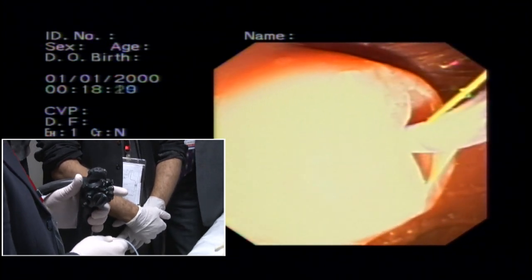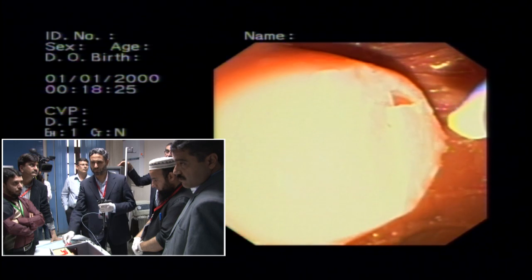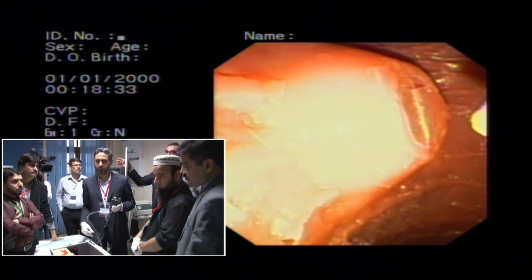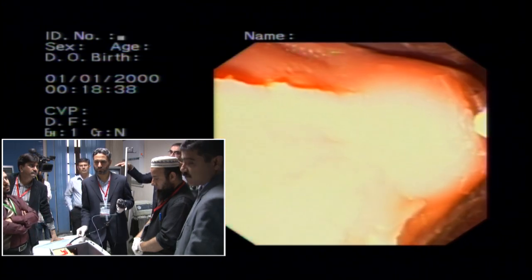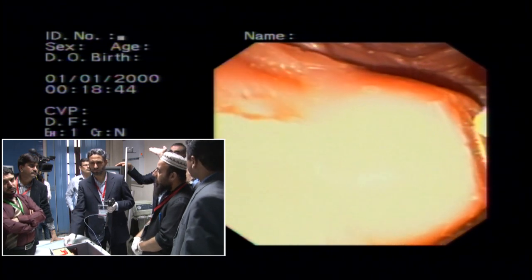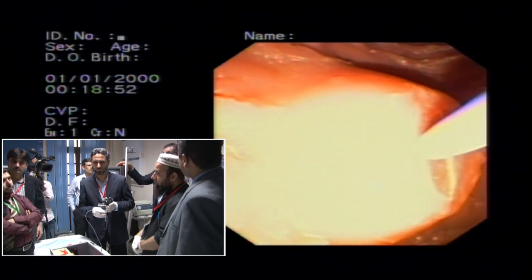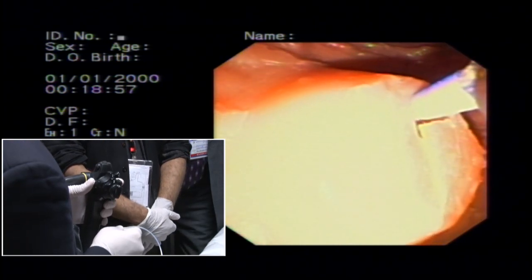जो आपका रेगुलर वायर डाल रहा होता है, अगर it is good, he'll tell you। खुद करते हैं, जब आप सीबीडी में होते हैं, unless you have a stricture or a big stone, the wire goes with a different flow. When you go into the pancreatic duct, it is a normal pancreatic duct, हाँ 2 to 3 mm ही होगी, तो वो वायर फंस के जाता है, खासतौर पे जब एंगल से जाओ, वहाँ पे वायर रुकेगा। तो टेक्नीशियन should know that, no sir, by and large good technicians are correct 8 out of 10 times. Immediately they'll say sir CBD, वो बता देते हैं, without screening, without anything.